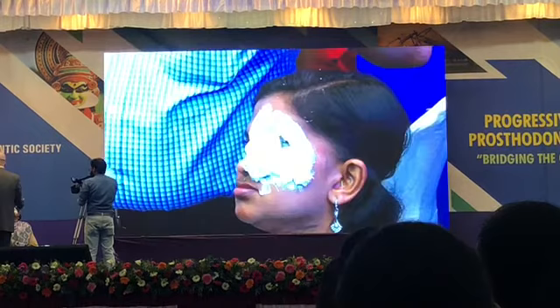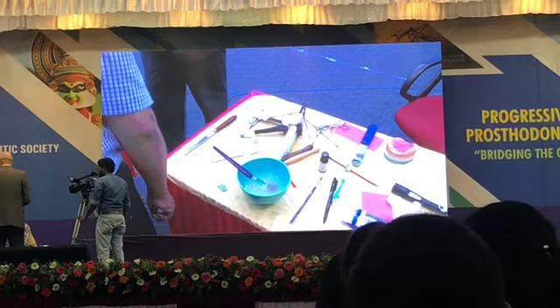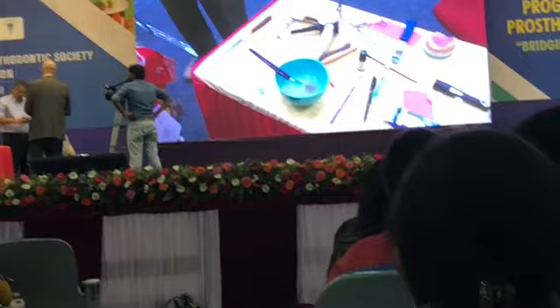Right. I don't need that, no. I just need another mix of plaster. See, this will set really fast now because it's sitting on top of the plaster that's already set. So technically you could make it very thick as you need to. And then we'll pull it off.